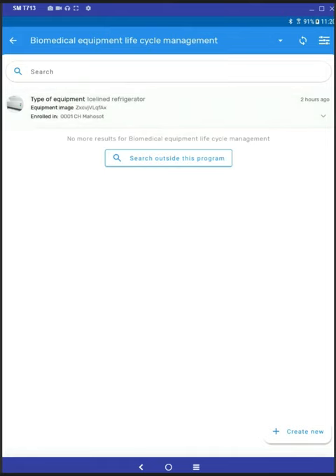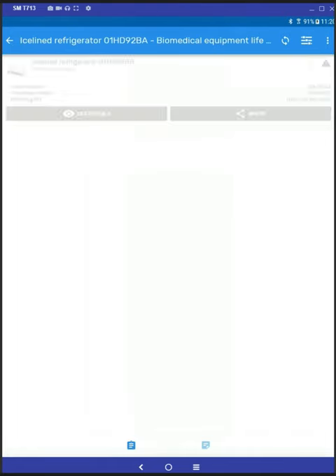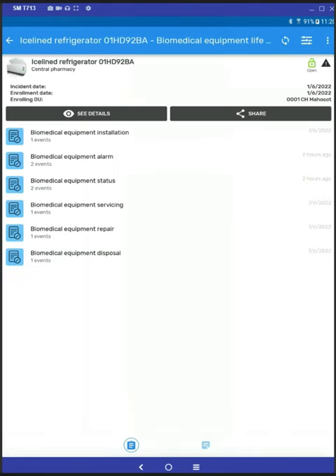By tapping on the icon again, it's going to open the actual tracker program. Here you are able to record the installation, record an alarm, record the status. The entire lifecycle of equipment is covered until the disposal.